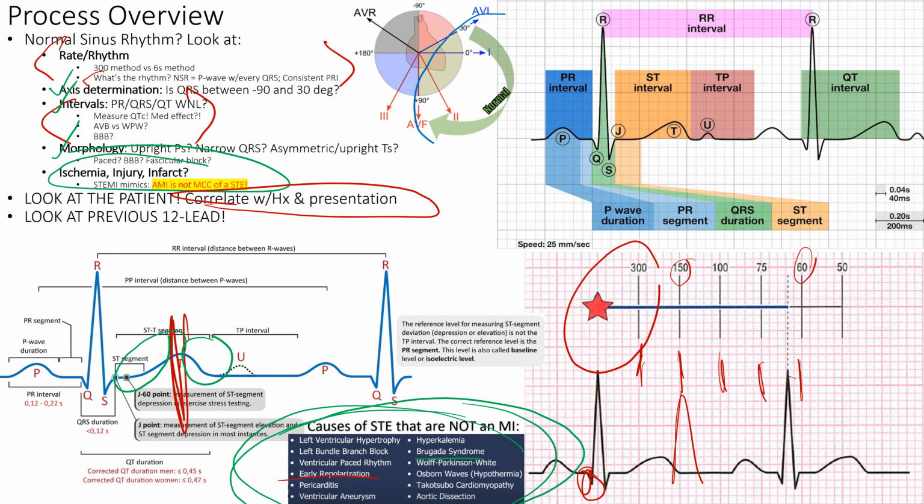And yeah, we'll touch base on axis just briefly, but these degrees here, about why this is up there, why that's down there, we'll touch base on why that happens, but you just basically have to memorize where they are, because it will tell us that, hey, if I have problems in 2, 3, aVF, you can see that's looking at the bottom of the heart, or the inferior portion of the heart. Why 2 is down there is not as important as that it is down there, right? Because it's just physics, and that's the only way to explain why it's there, right? There's no other logical reason.